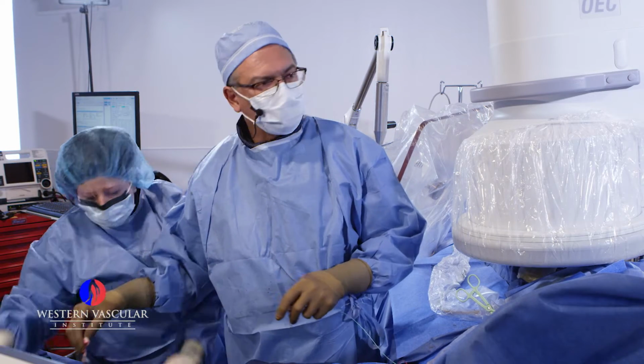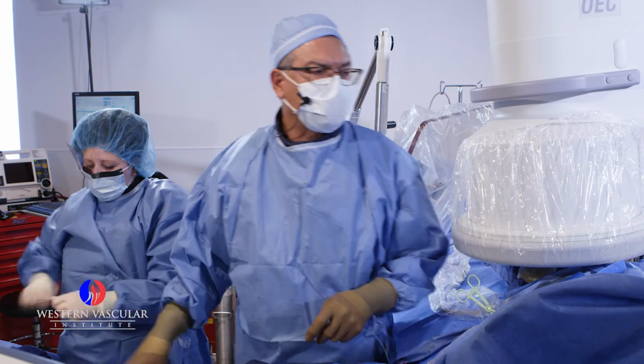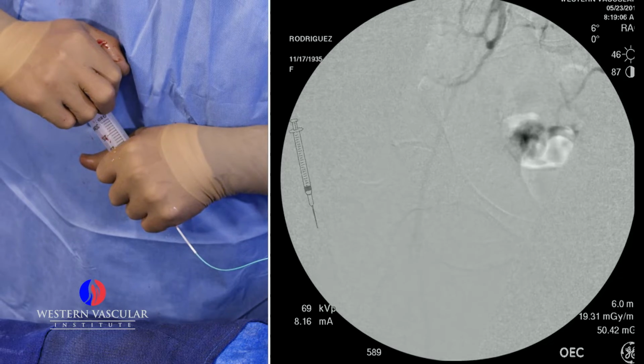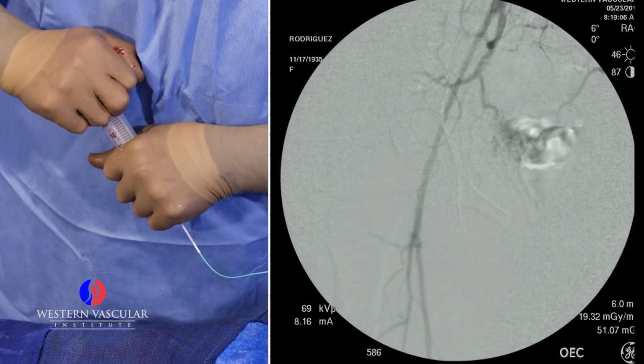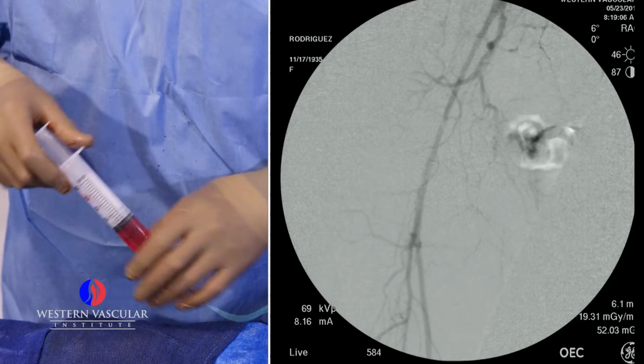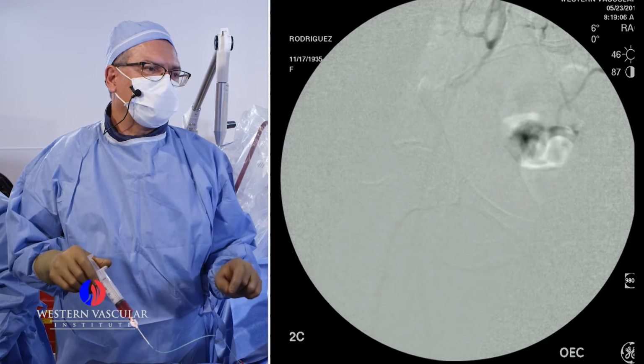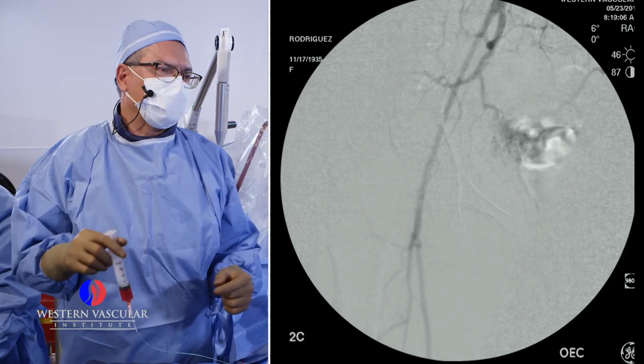All right, let's do something here. Let's do another picture, and let's look at the right groin. Let's see if we have what we call reconstitution. So I'm injecting in the aorta, the flow is coming through collaterals, and you can see the artery right there. So that's telling me that I also have a chance to come from below up and try to connect the two ends of the blockage.